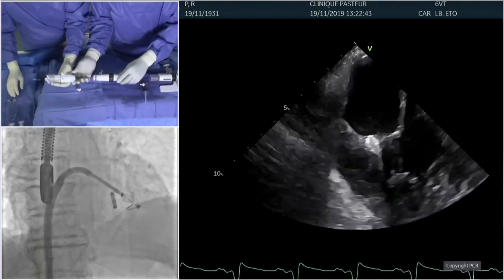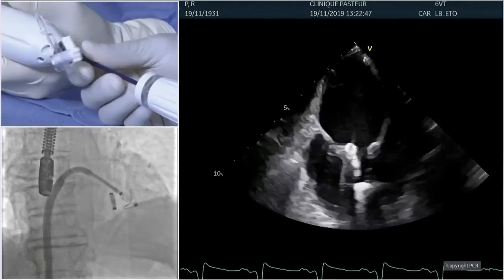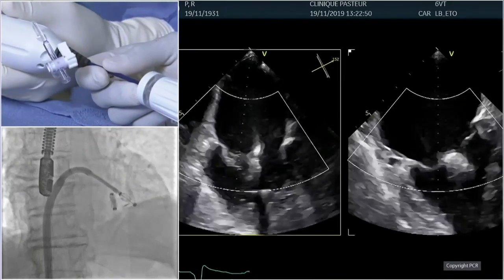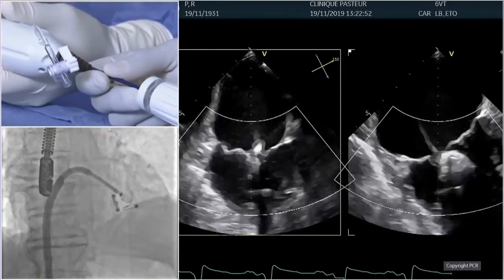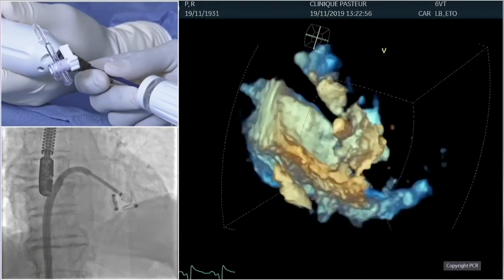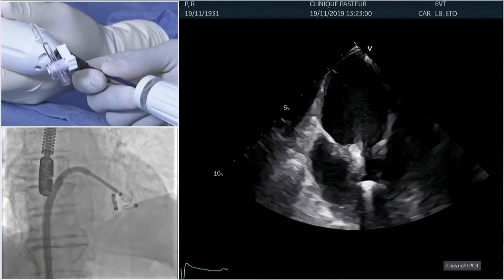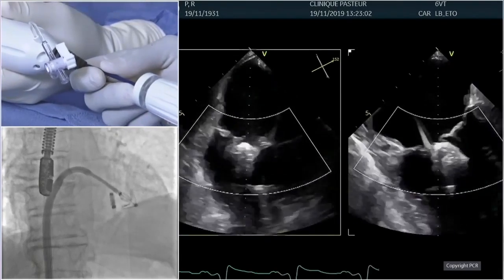Maybe we'll need to correct a little bit. Check the clocking in 3D maybe again. Yeah. Okay. So let's go back in 3D. We have 3 minutes, 5 minutes, so it should be fine. No, you have time. Just take your time. Cool. So we need to check first the clocking. Oui, un peu trop près aussi, pousse un peu tout l'ensemble.